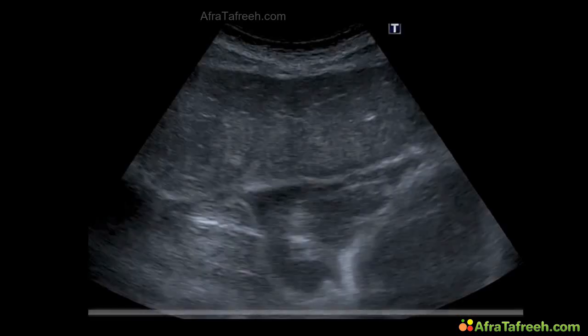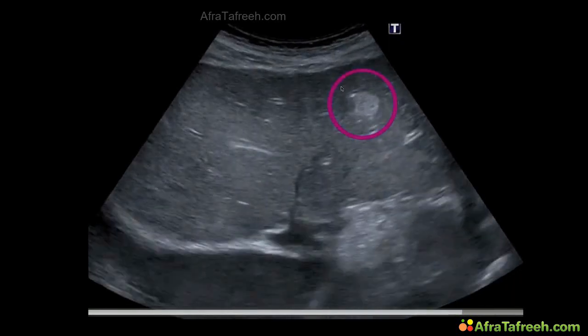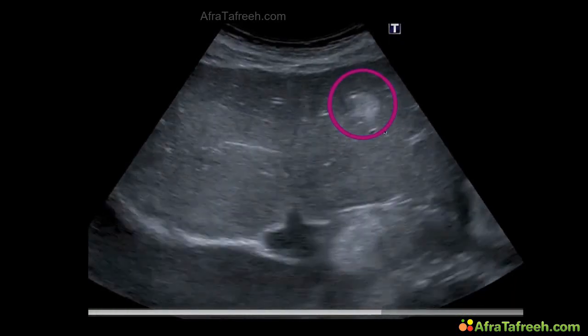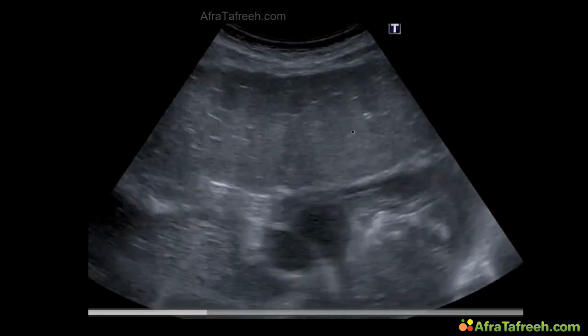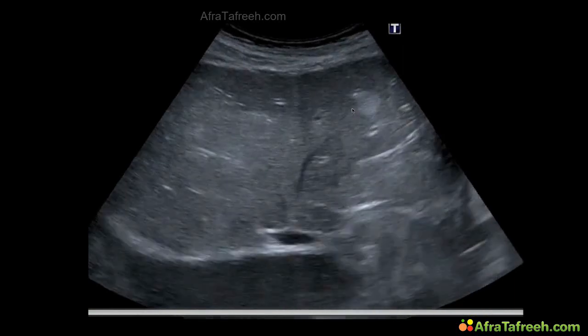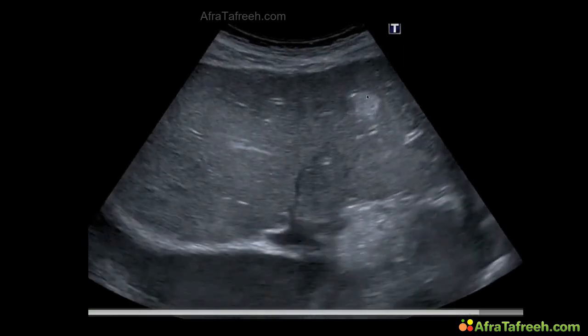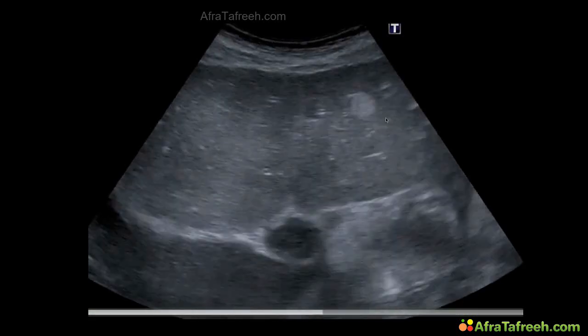This is a video clip. And you can easily detect over here on the right side of the picture, again, a really hyperechoic white lesion like a snowball. It's got clear, smooth borders here in the left liver lobe.